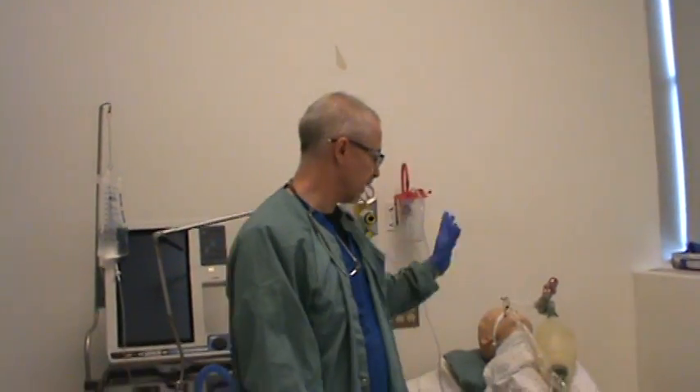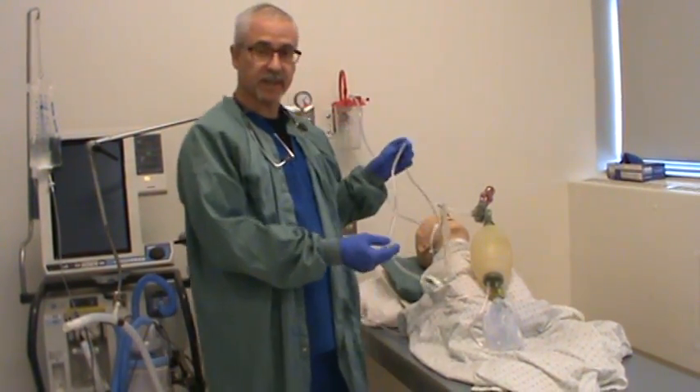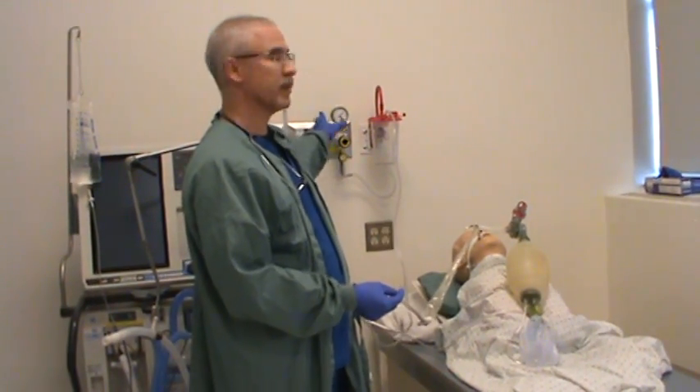In this video we're demonstrating a patient that has an endotracheal tube in — a size 8 endotracheal tube with a closed suction system attached, which is a size 14 French. That is the appropriate size closed suction system for this patient. The closed suction system is attached to suction tubing which goes to our suction unit, which is attached to our suction regulator.